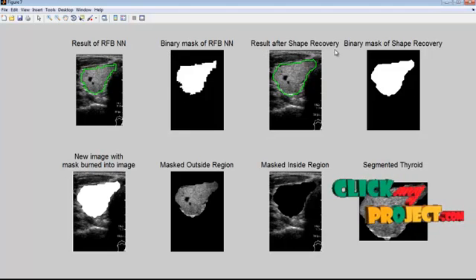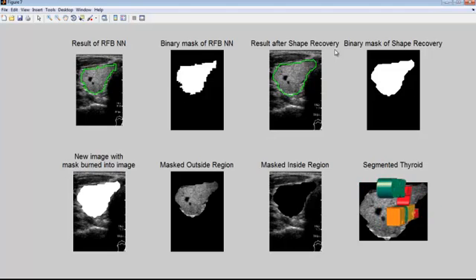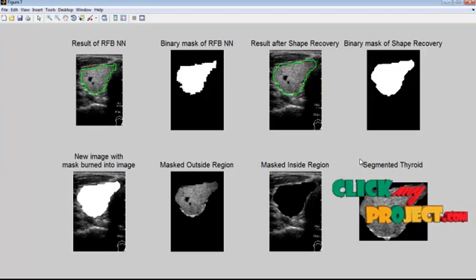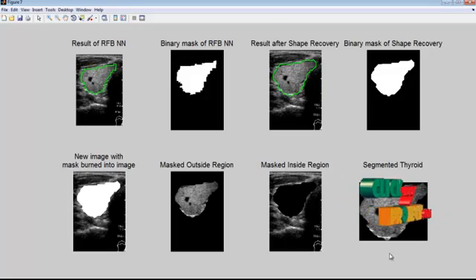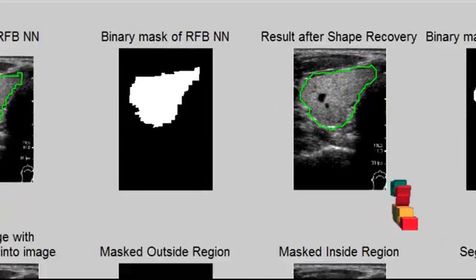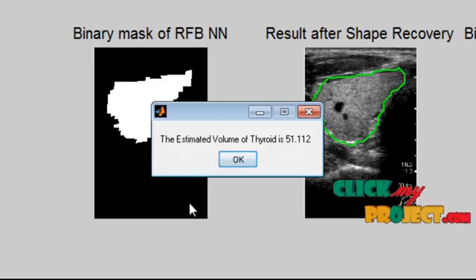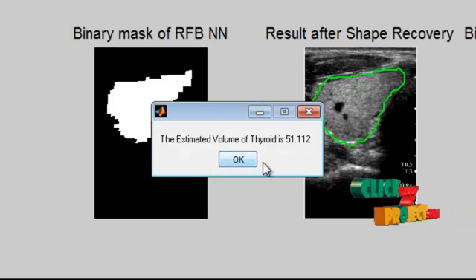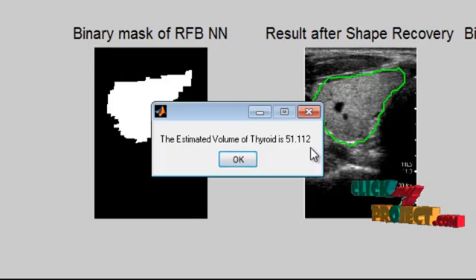The shape has been recovered using the convex hull method. We can see the inside region, outside region, and the final segmented thyroid region. The estimated volume of the thyroid region is 51.112.